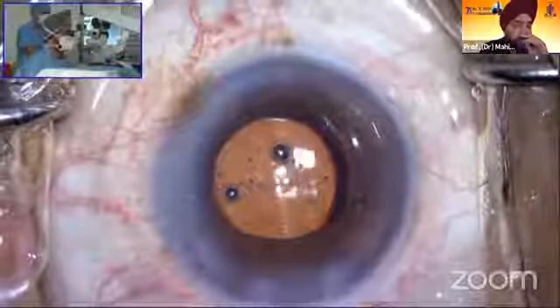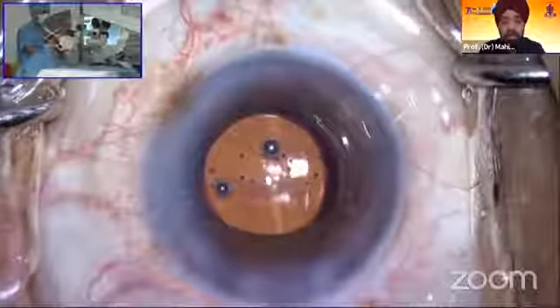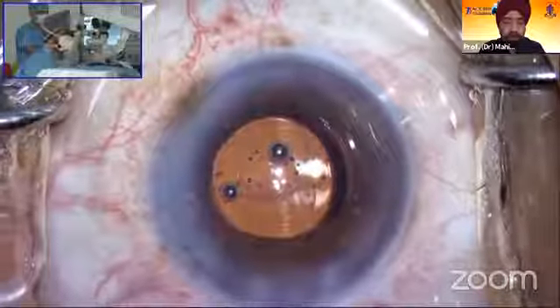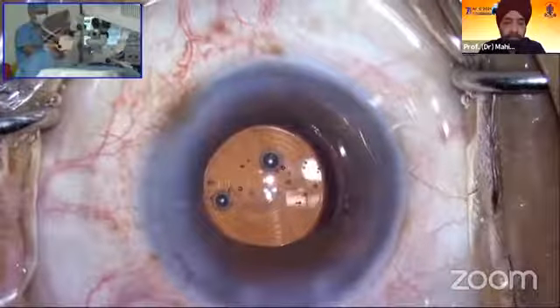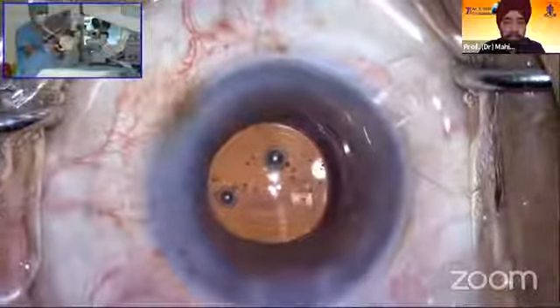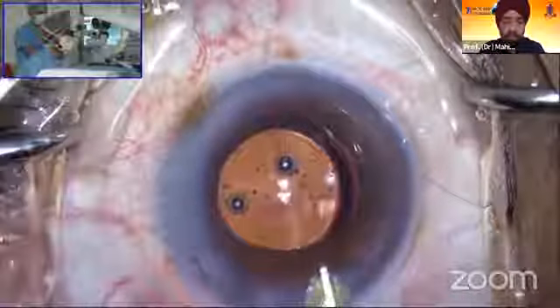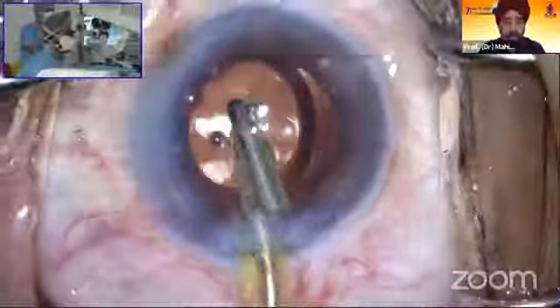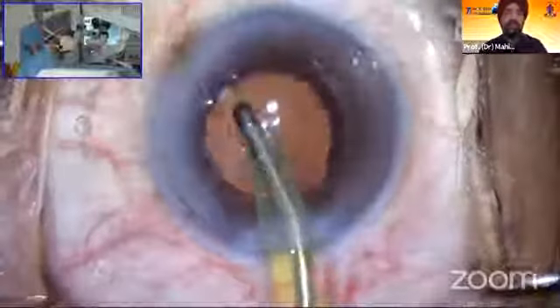The reading ability at 33 centimeters is good, and intermediate vision is also good. What is claimed — though I haven't personally run these studies — is that night vision contrast diminution in low contrast situations is not present with this lens. Now we'll remove the viscoelastic. One limitation at this point is that we still don't have the toric variety of the Synergy or CRV lens.